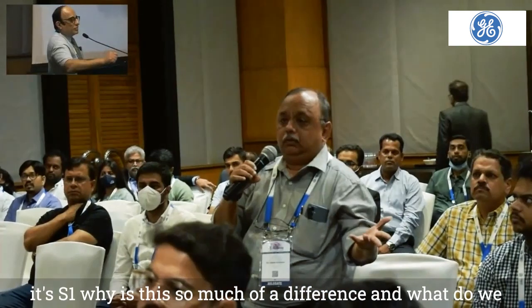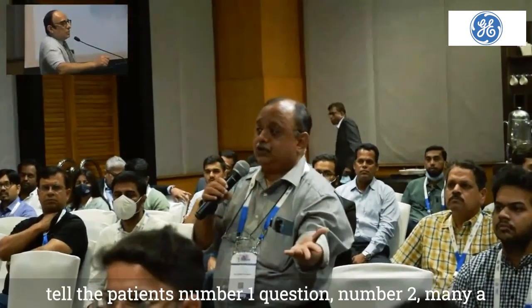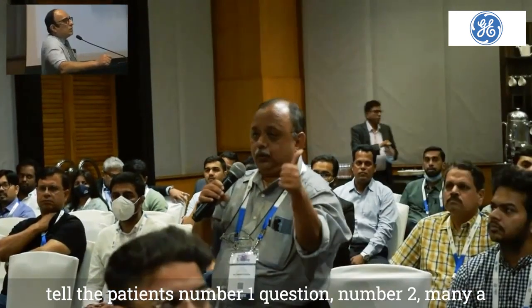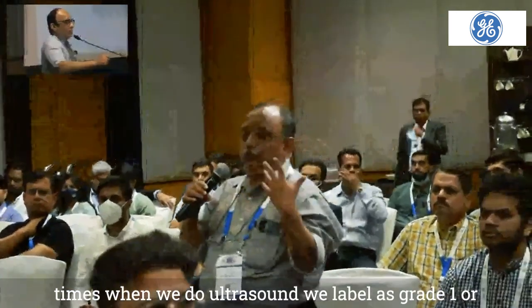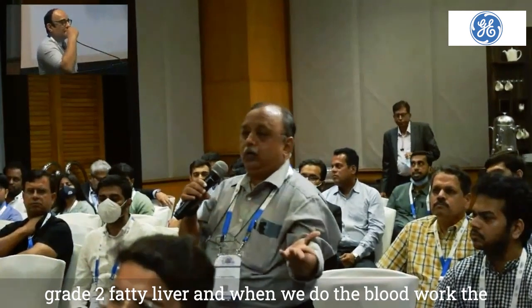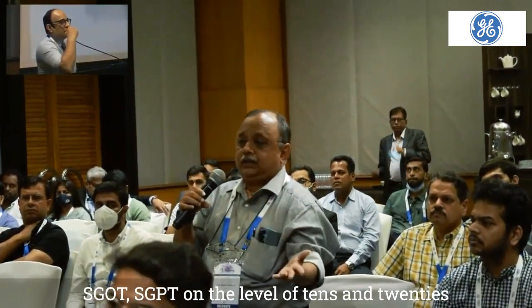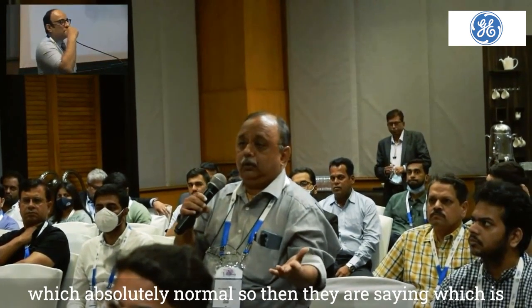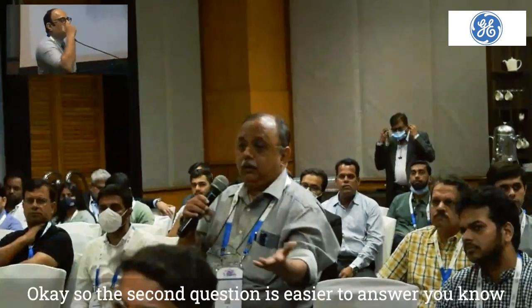Why is there so much of a difference? And what do we tell the patients? Number one question. Number two, many a times when we do ultrasound, we label as grade 1 or grade 2 fatty liver. And when we do the blood work, the SGOT, SGPT are on the level of 10s and 20s, which is absolutely normal. So then they are saying, which is right? Is the blood work right or is this right?